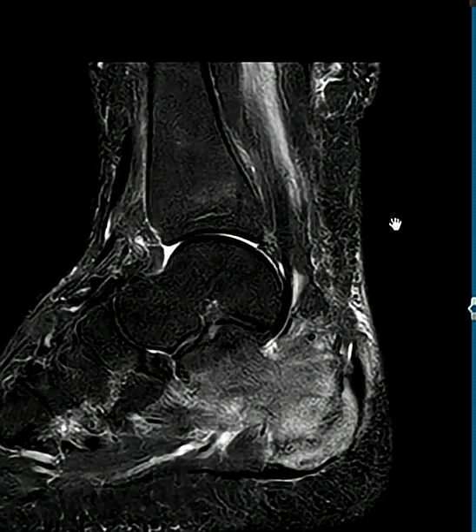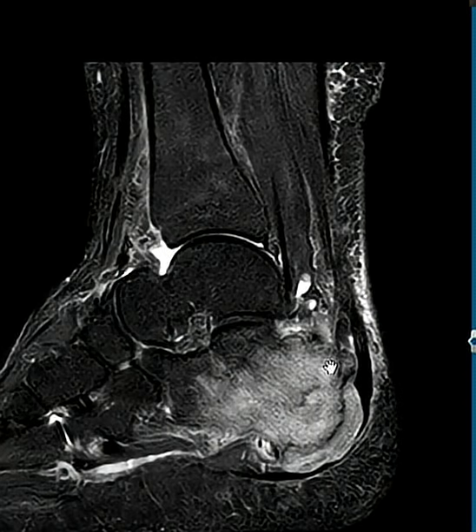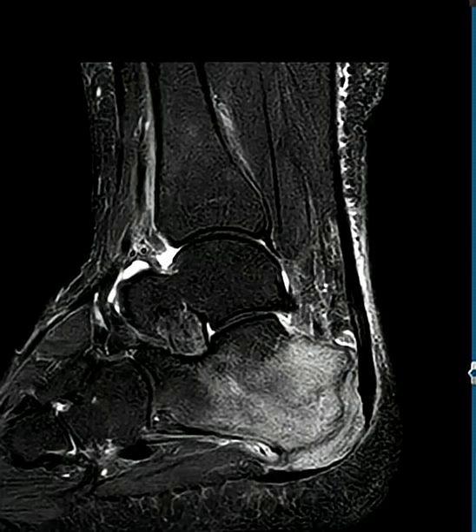So this is a new thing called a snapshot that shows marrow signal changes much, much better than x-ray, and the cost is comparable. Thank you very much.